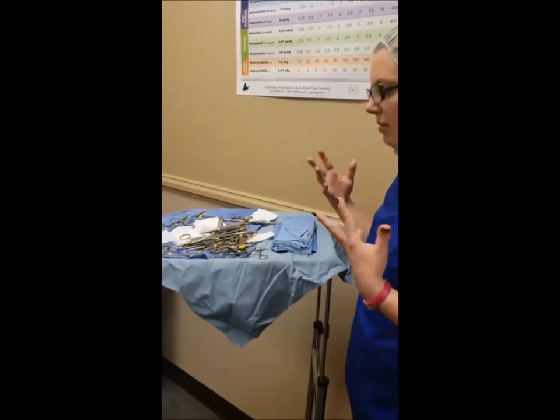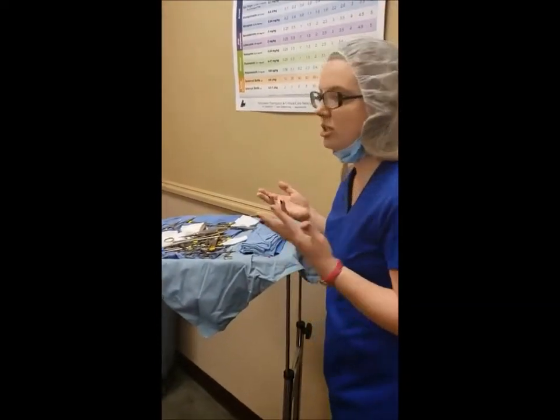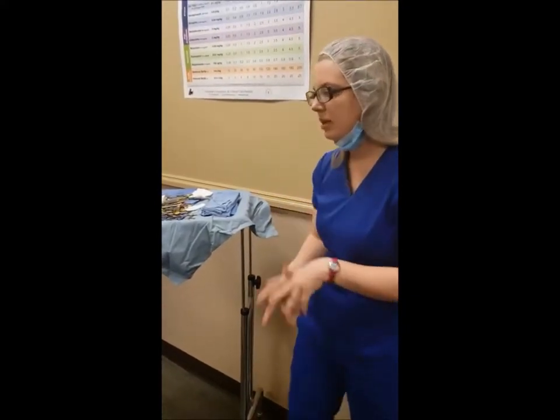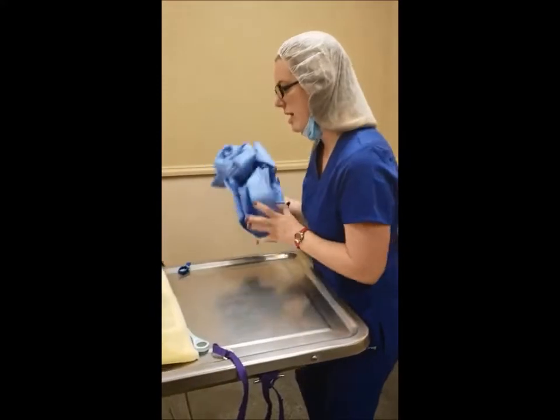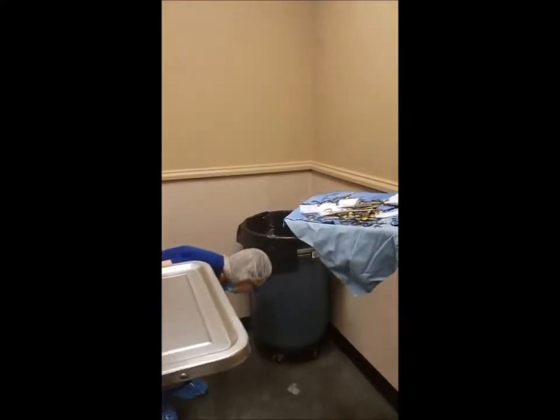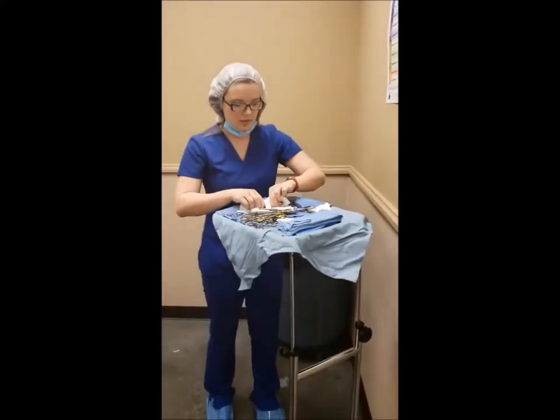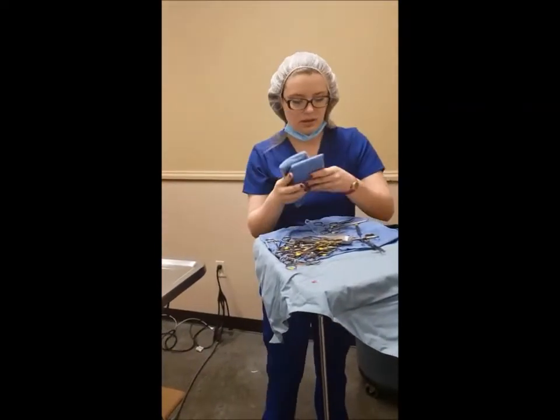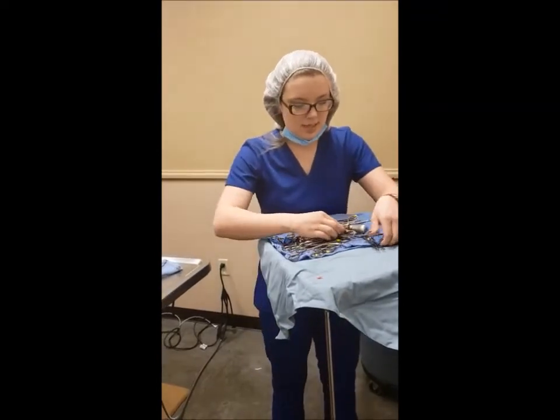Okay. If there is any hazardous waste, we would want to go ahead and dispose of that properly. So if there were any body parts, such as testicles, or any type of bodily fluids in here, we would want to bag that up appropriately and dispose of that correctly. So we've already done that. So I'm going to go ahead and just clean this up. So I'm going to throw away our drape, throwing away trash, picking up things off the floor. I'm going to get this ready to go to the sink.